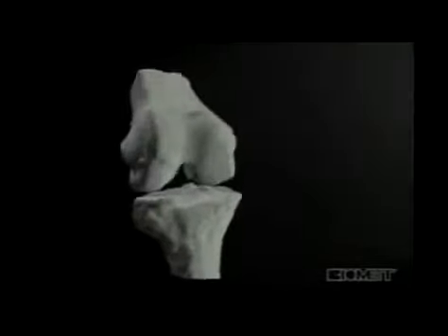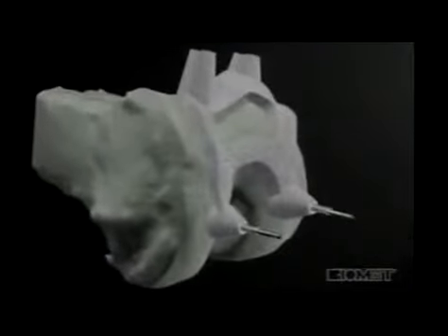Now you had some more clips for us that you were going to show. What were those? Well, right now we're going to show a clip. This is an animation, actually, of the operation. You can go ahead and run that. If you have a weak stomach, it's okay. It's just a cartoon. But this shows the jig going on the end of the femur, and these little drills will hold it steady.